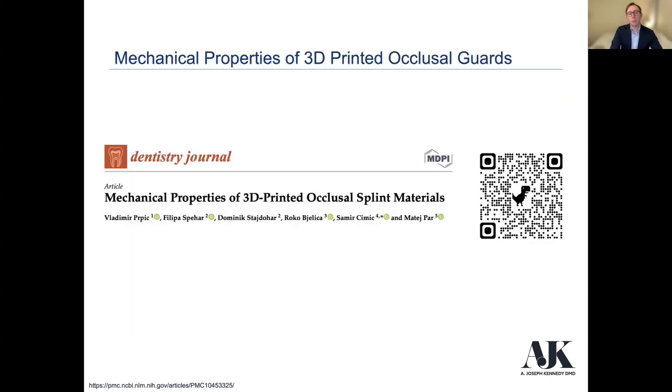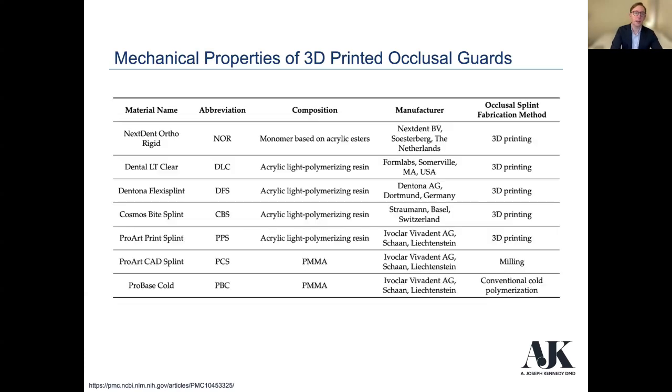So what are the mechanical properties of these types of guards? Is this something that a 3D printed or resin-based occlusal guard is going to withstand the forces that many of our patients, especially the ones that need an occlusal guard, are going to be putting on it?